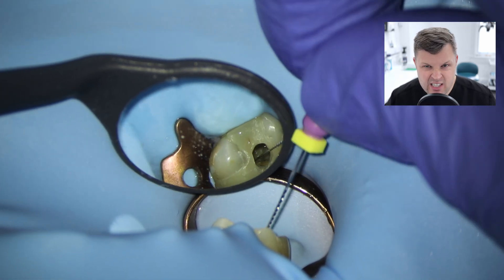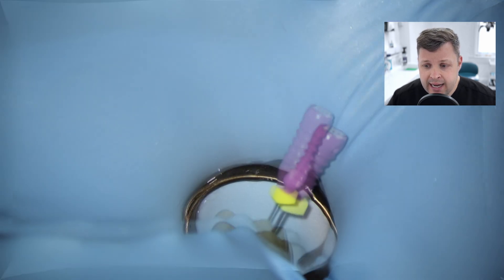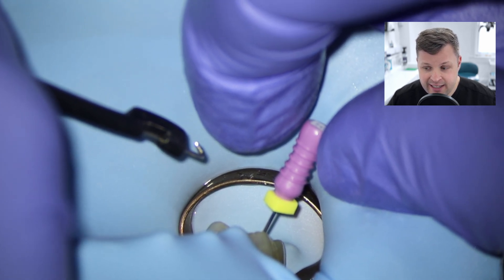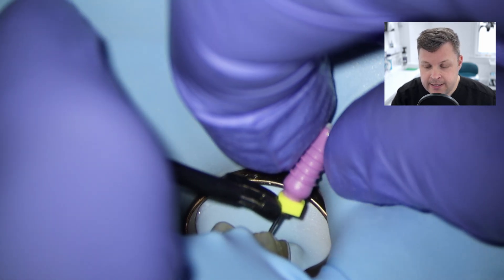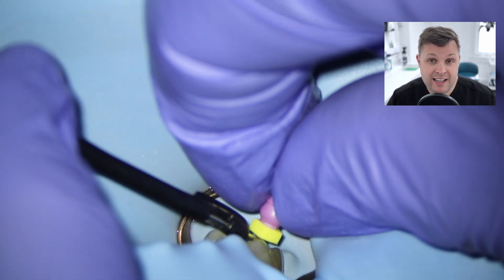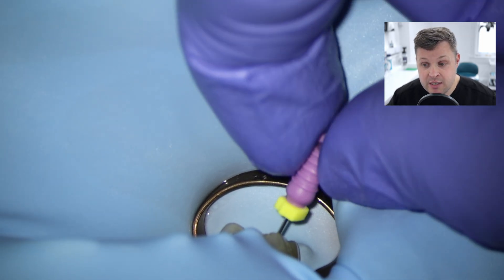With these small access cavities, straight line access is sometimes not the best. I'm going to go straight for the working length of the palatal because I know the palatal is going to be quite wide. I am using a size 10K file here. As I hook up the apex locator, I feel like it's getting a little bit difficult to get to length - it's quite tough. The reason I'm struggling to get to length is essentially because of the truss access, because the file is getting gripped further up due to not having straight line access.